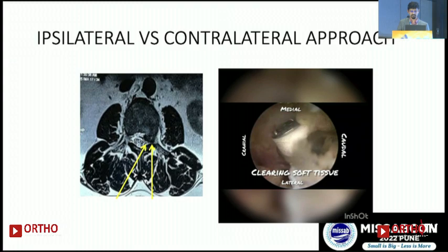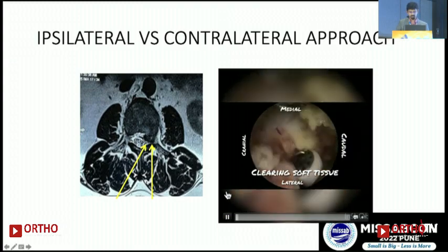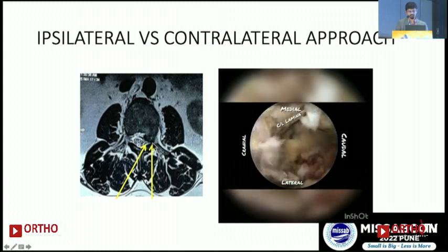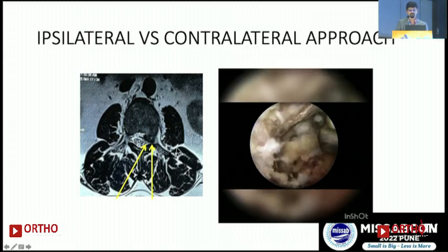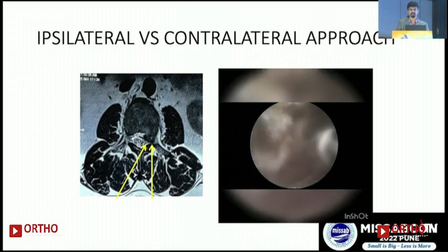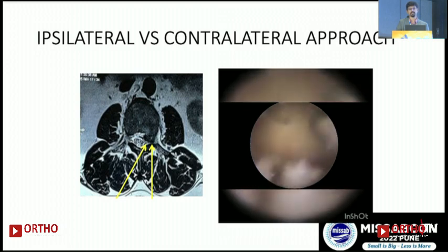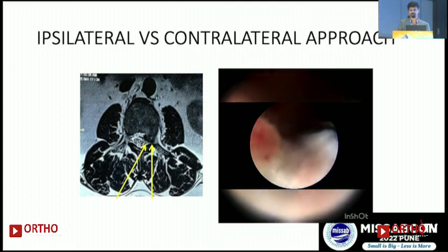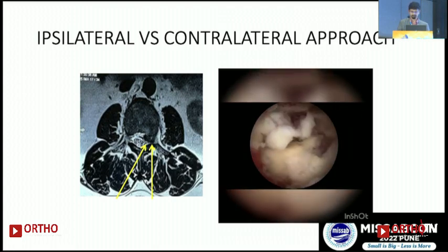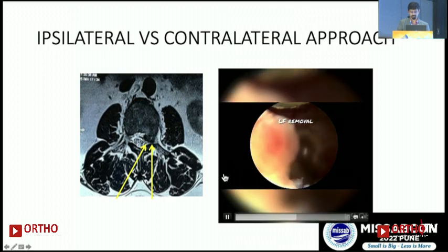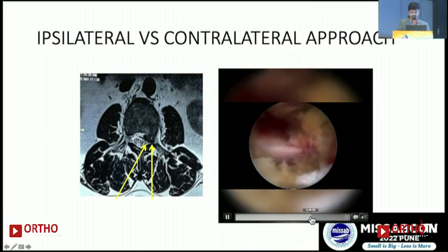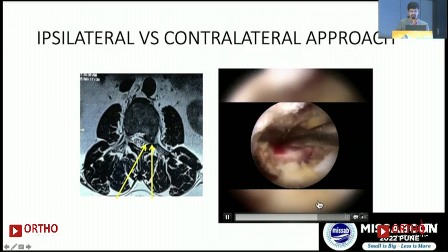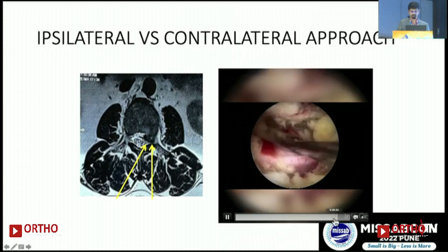This short video demonstrates the upper lumbar disc herniation case. The only difference is that contralateral bony work is performed more extensively with UBE. You can see three nerves: the ipsilateral traversing root, the contralateral exiting root, and the contralateral traversing root. Three-root decompression can be achieved without violating the facet. This shows contralateral discectomy from the axilla of the exiting root, with the disc fragment visible.